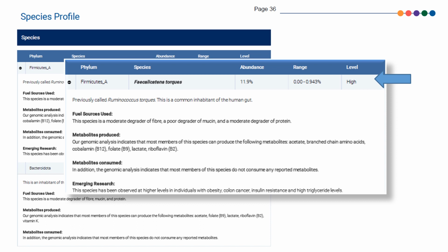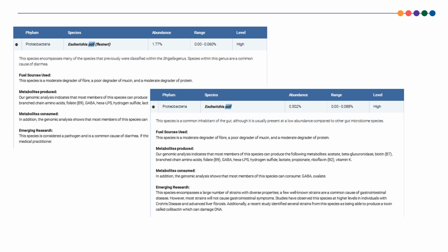Ultimately, the first few pages of the report outline the best course of action clinically in the report summary section. We did see earlier in the report review section that there were 2 potential pathogens present, and this section can give more information about those. The organisms are not in alphabetical order, but in order of abundance. So you can use your search function, such as Control F, to find a specific organism.